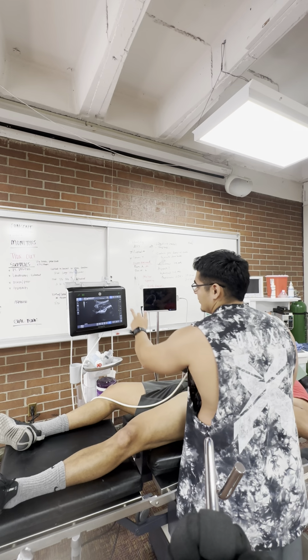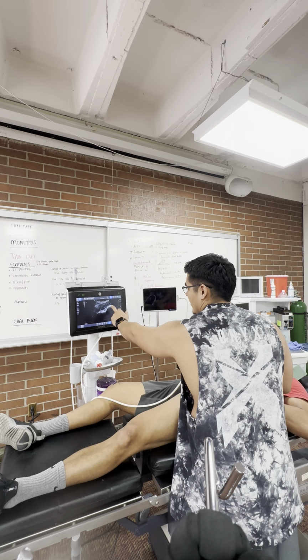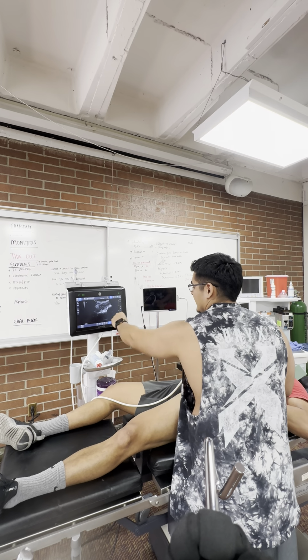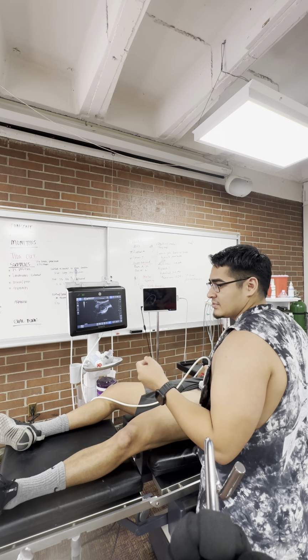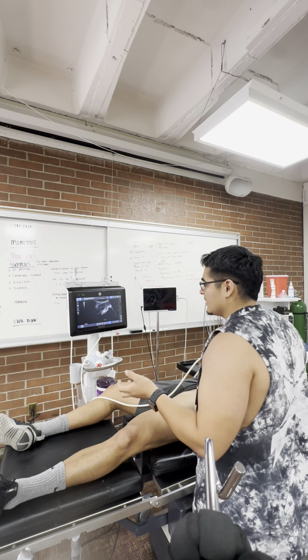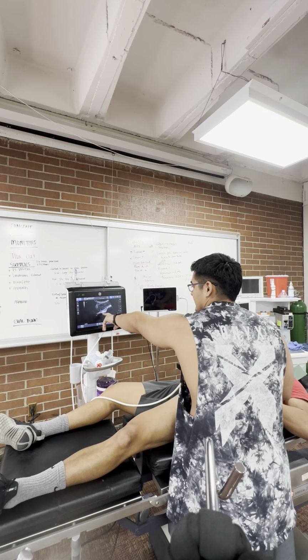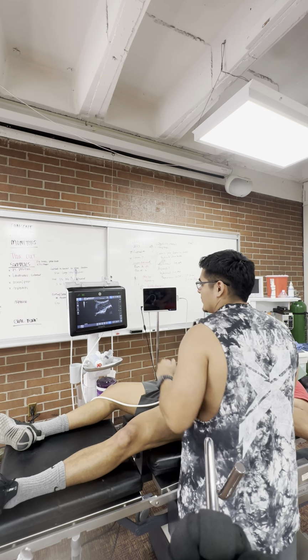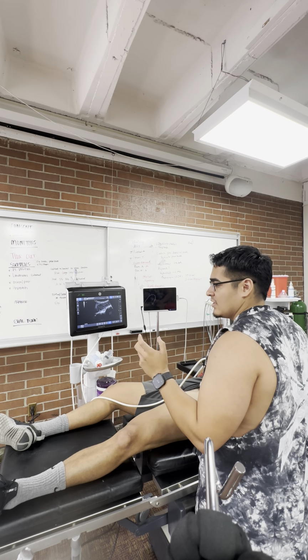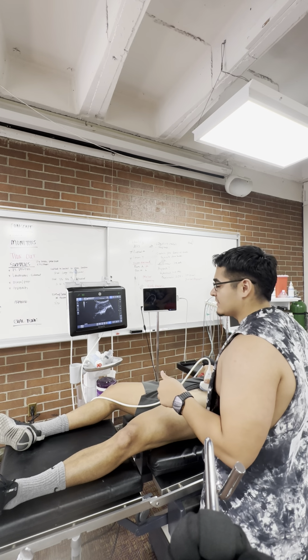You want to go from lateral to medial, and then you want to hit bone. After you hit bone, you want to walk off the bone and just advance it just slightly underneath and hydrodissect. Aspirate 1 to 2 cc's. You want to hydrodissect with about 1 to 2 of sterile saline, and the psoas tendon will start to come off that pubic eminence, pubic ramus, and so you want to inject about 15 to 20 cc's of 0.25% bupivacaine, making sure to aspirate about every 5 cc's in between, that you're not in the blood vessel.